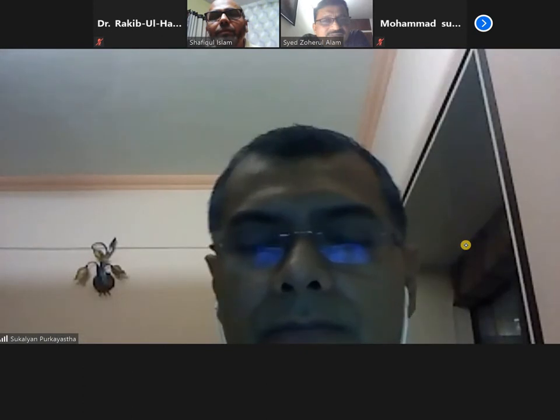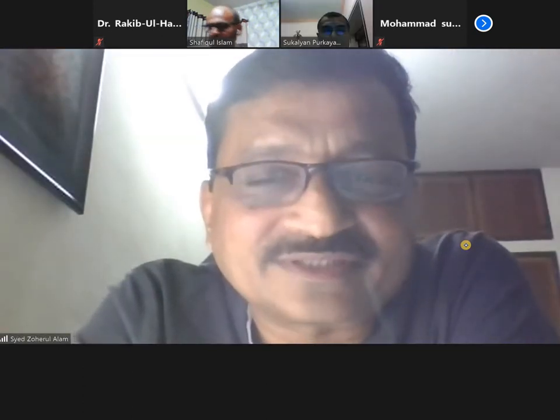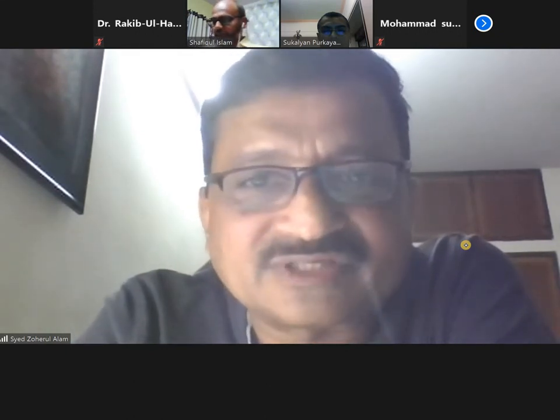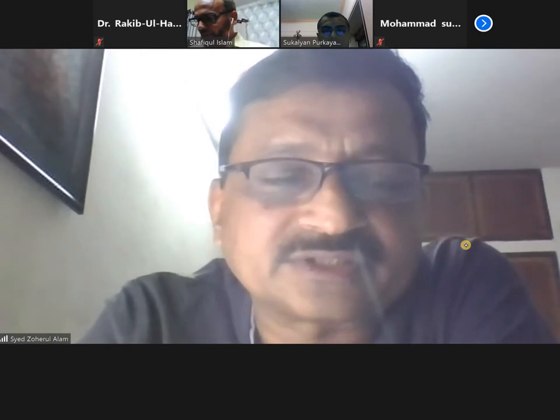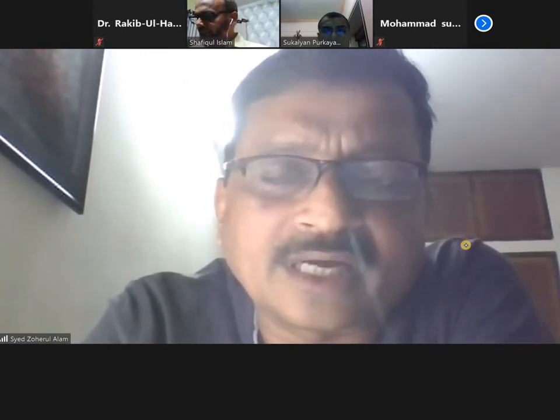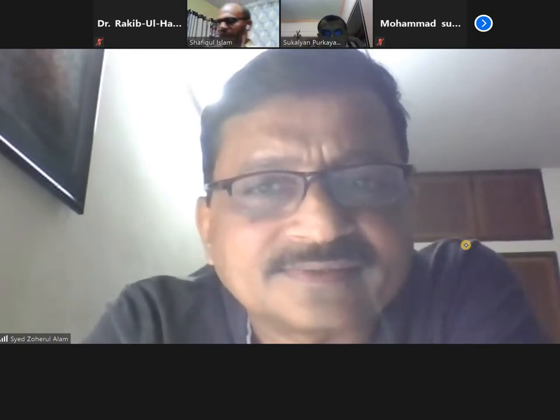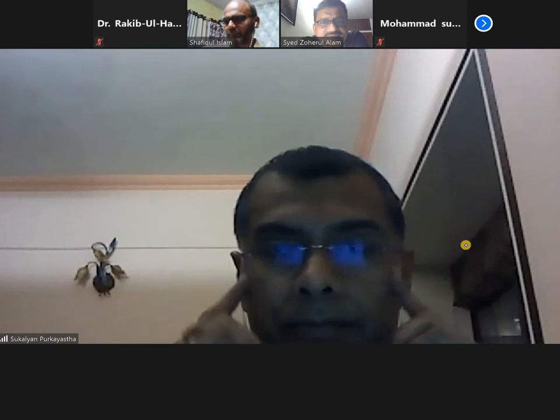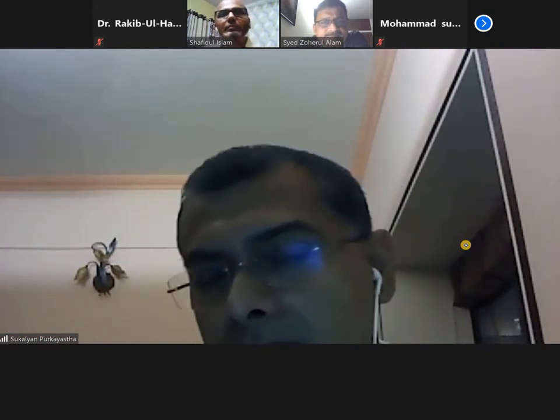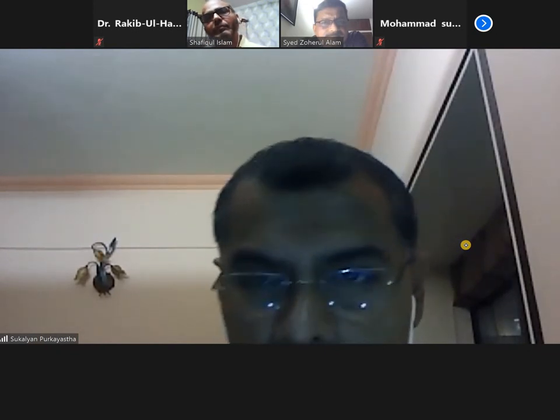That was a very nice session, that I wanted to say first. And second thing, in case of type 1 cavernous fistula, from your experience, what do you suggest? One should use coil or onyx, or case to case it should vary? Case to case it will vary, but cavernous sinus fistula, usually it is dealt best by transvenous route.